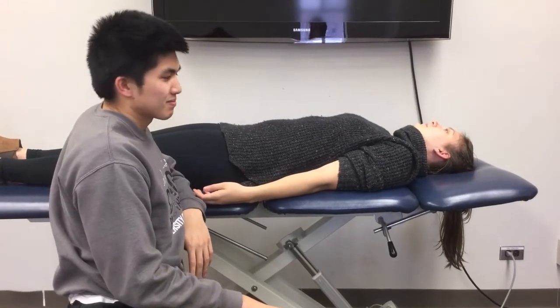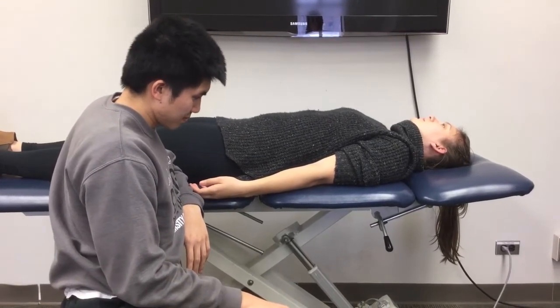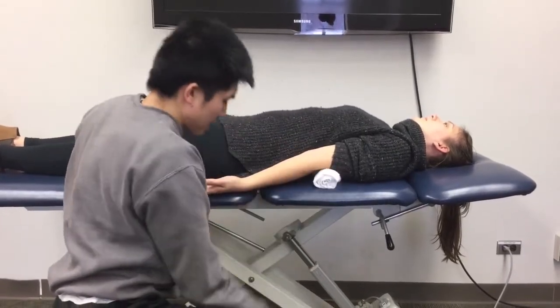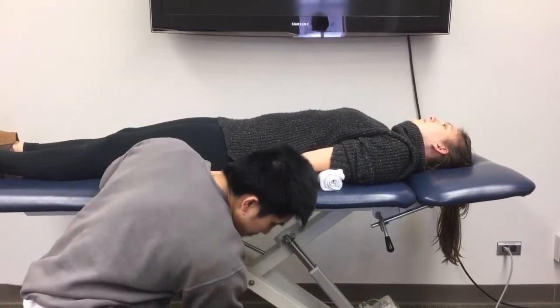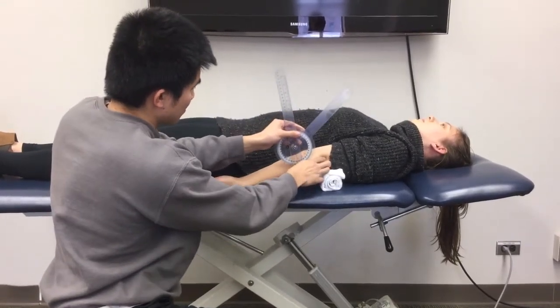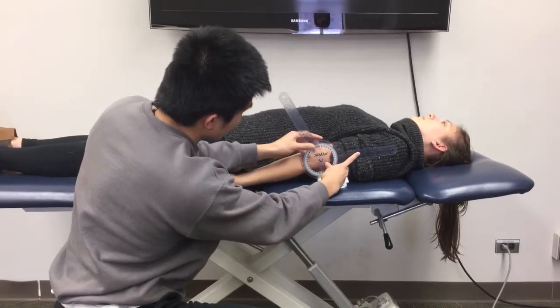This video is for elbow extension range of motion. The patient is supine, forearm in full supination, with a towel under the humerus — this allows you to measure any hyperextension the patient may have. Same as elbow flexion, your fulcrum is the lateral epicondyle of the humerus, the proximal arm is the lateral midline of the humerus referencing the olecranon process, and the distal arm is the lateral midline of the radius.